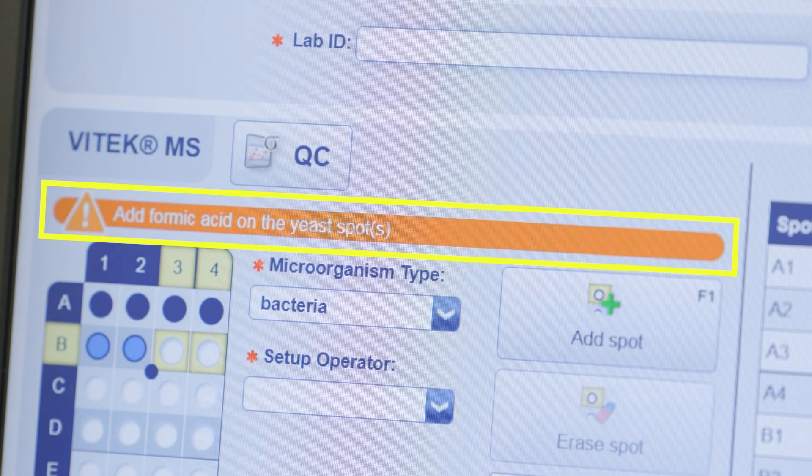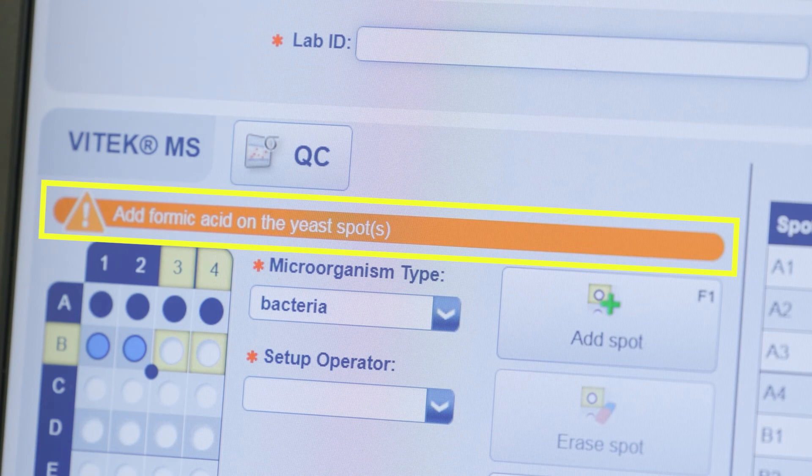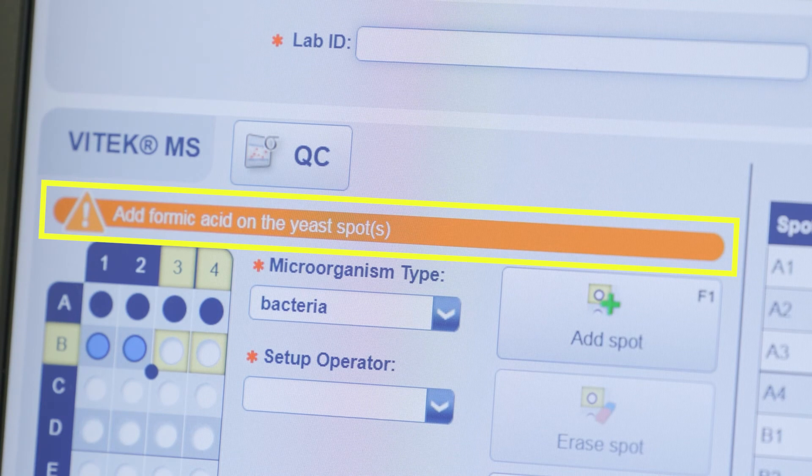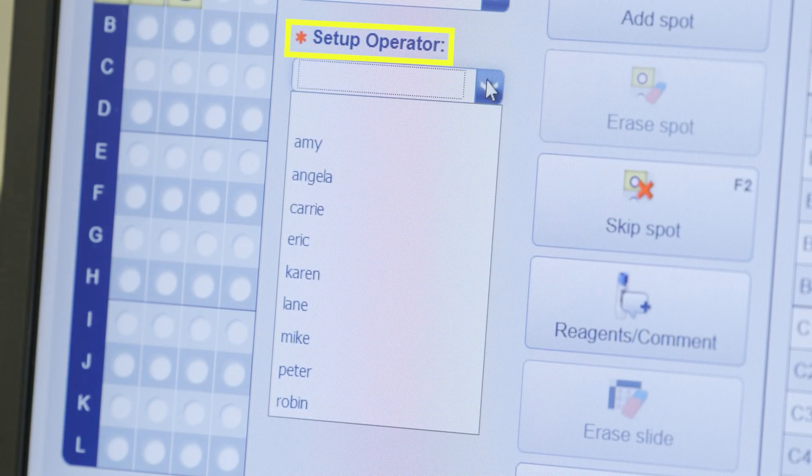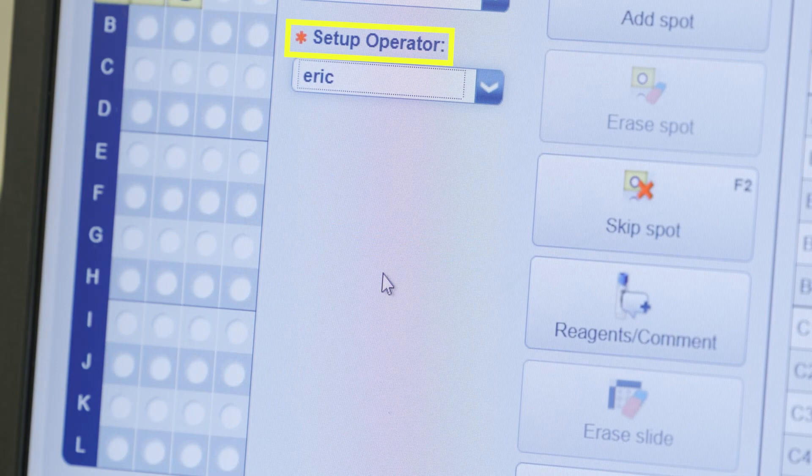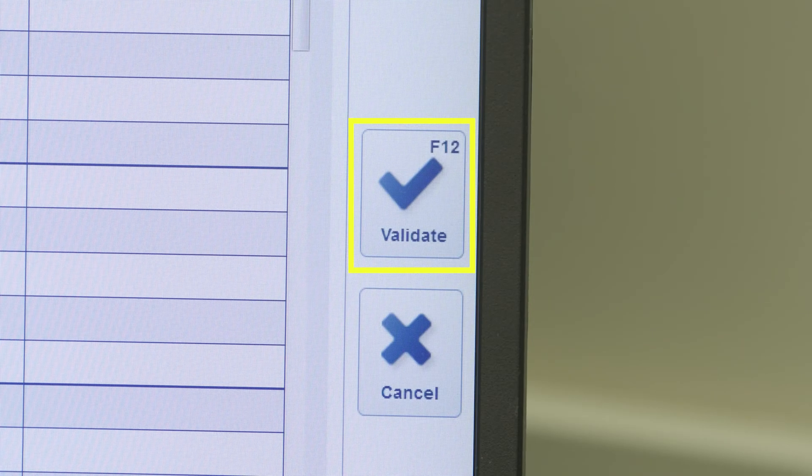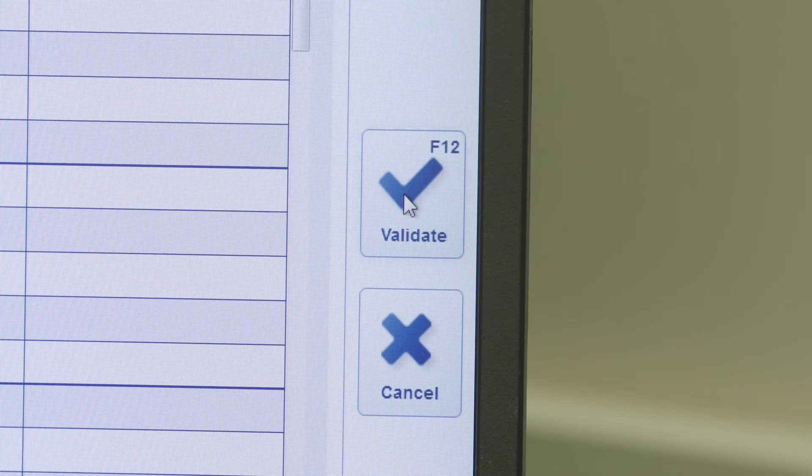Note, you will receive a reminder to add formic acid to yeast spots when running fungi. Select setup operator if configured. Click validate or use the F12 key on your keyboard.